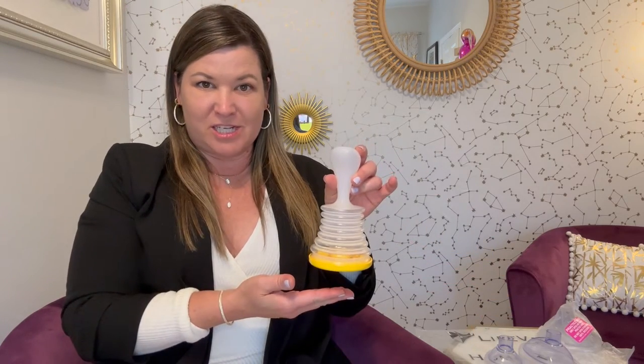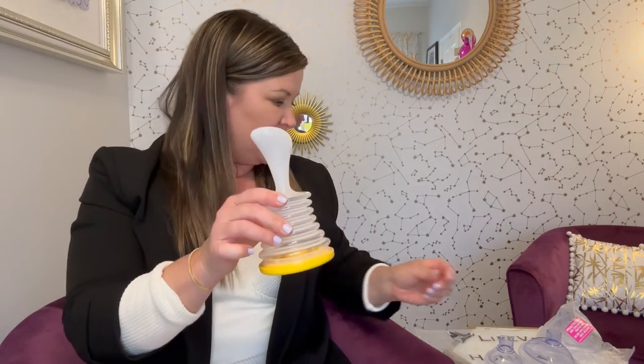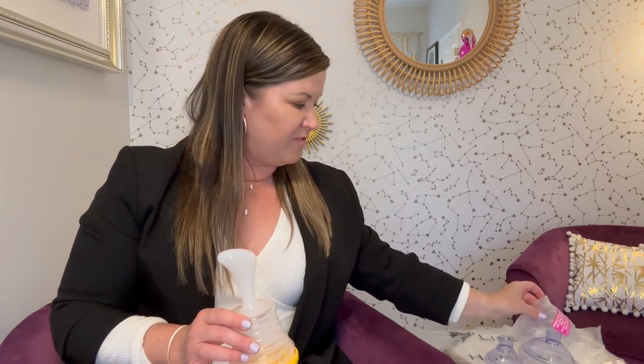Life Back, if you haven't heard of it, is the original choking rescue device. This is the essential component of a Life Back. When you get a Life Back, you get what looks like a plunger, and then you get three masks — a practice mask, and every Life Back also comes with an adult size mask as well as a child size mask.